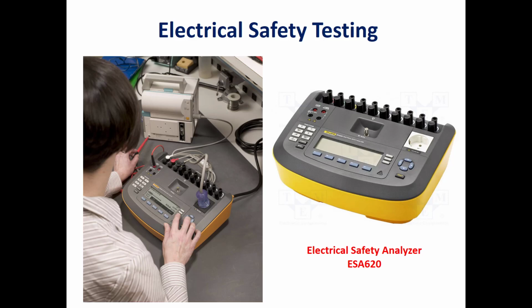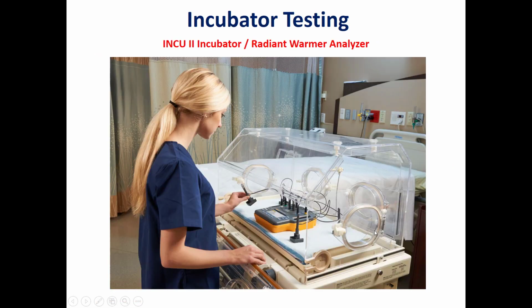The inspection and preventive maintenance for an infant incubator. In order to perform the inspection and preventive maintenance, the IPM, as we call it, for an infant incubator, we need an electrical safety analyzer, and we also need an incubator analyzer. An electrical safety analyzer could be similar to the ESA 620, and the incubator analyzer could be similar to the INCU 2 incubator analyzer. Both of them have been developed by Fluke Biomedical.